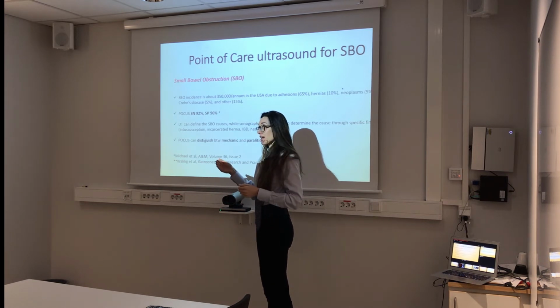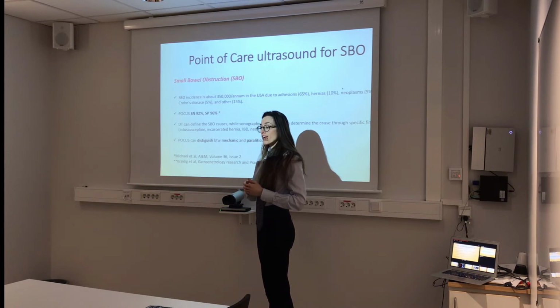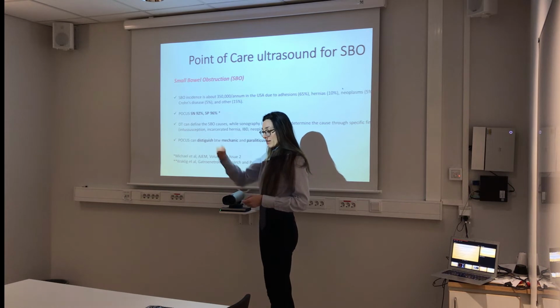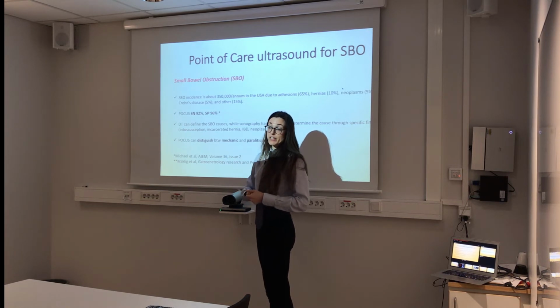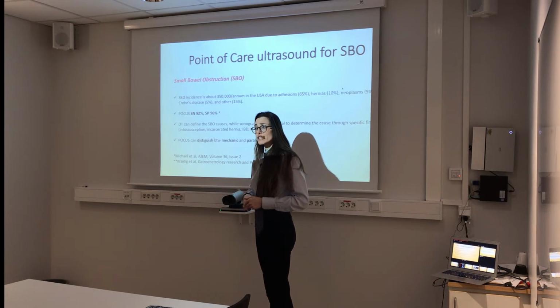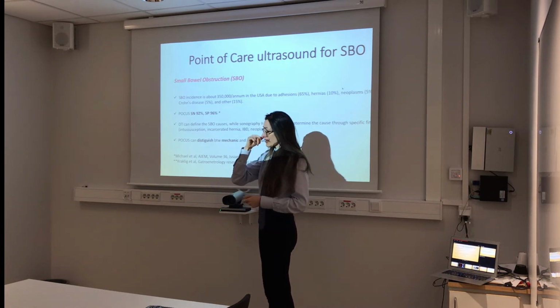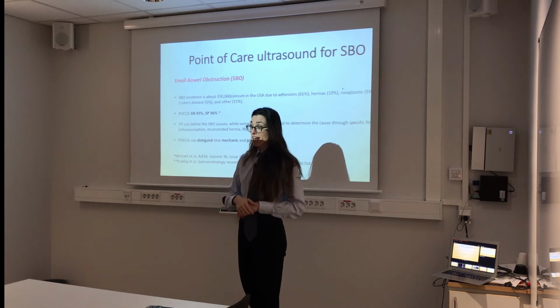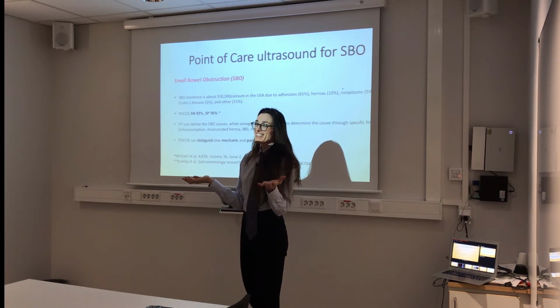In case of people that have many episodes of small bowel obstruction, if you see it with the ultrasound, and it happened exactly like 3 weeks ago to me, an old lady, 85 years old, had like 10 episodes of small bowel obstruction, came in with abdominal pain, sudden onset vomiting. There was a clear small bowel obstruction. We will see how it looks with the ultrasound. I put the nasogastric tube on, and I called the surgical team, and I asked, sorry, do I really have to do the CT? The surgical team came down and said, well, this is very well known. Probably we do the passage directly, and this is how it went.